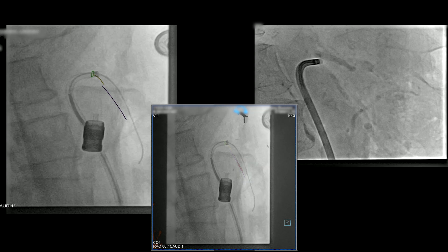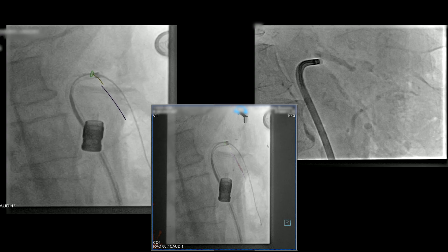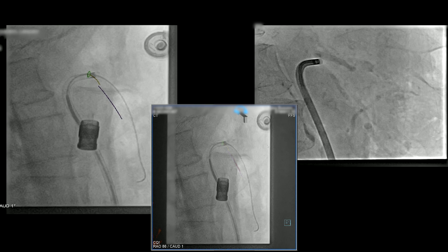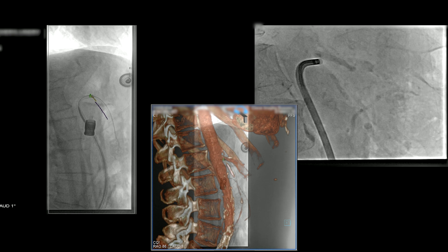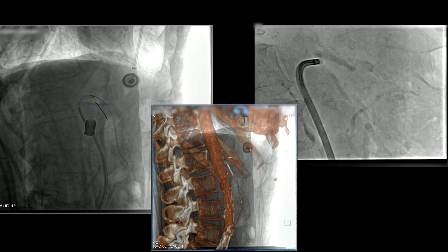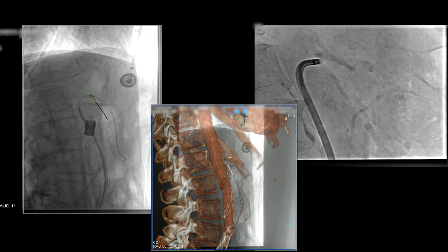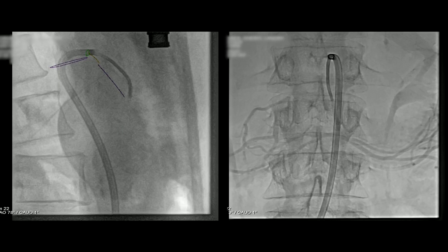When we did this, you line the circle up on the end of the Tour Guide with the circle — both of these should look like lines if you get the orientation properly, and essentially the first time, the wire went right on down through it. The next step is to confirm that the wire is truly endoluminal. On the fluoroscopy we are fading in and out the CT overlay, continually checking by looking at these different images so that you know the orientation of that wire and you've got a pretty good idea that the wire is in the lumen.